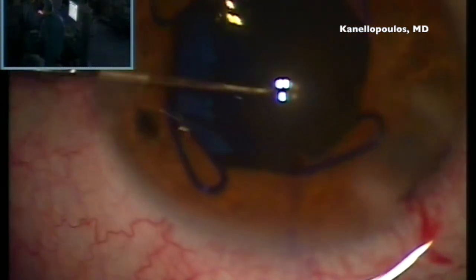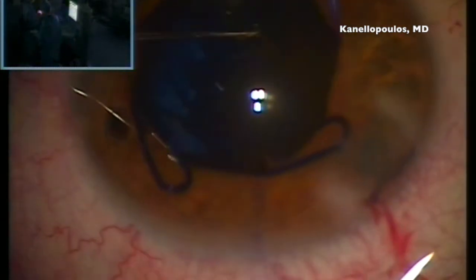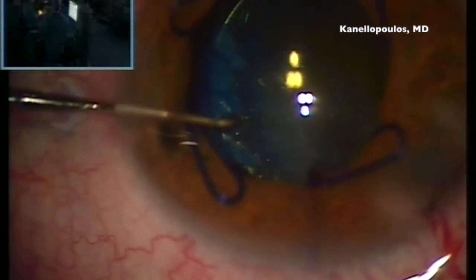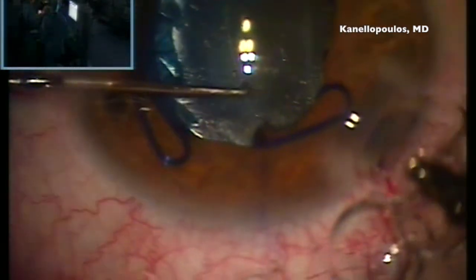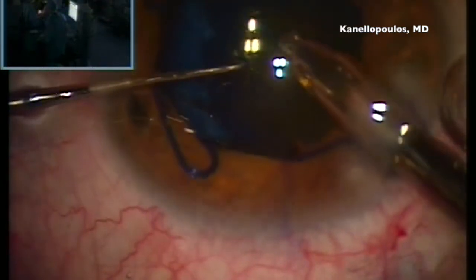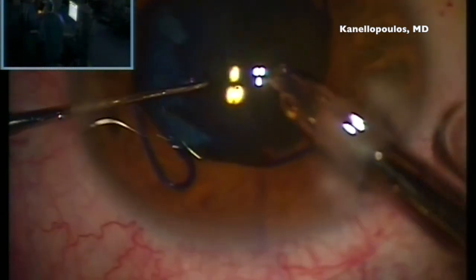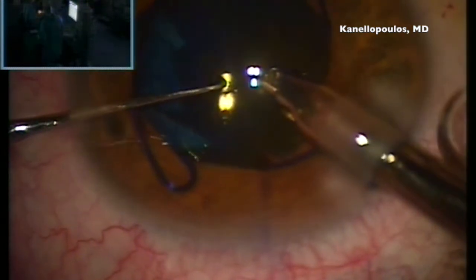And then, of course, we'll finish with removing the Malyugin ring, for which, as I mentioned before, I only have good things to say as far as my personal clinical experience, which is also the global ophthalmic community experience, with it really expanding the safety and accuracy capabilities for small pupil phacoemulsification and intraocular lens implantation. So we're removing the residual viscoelastic here, which is mainly methylcellulose at this stage.